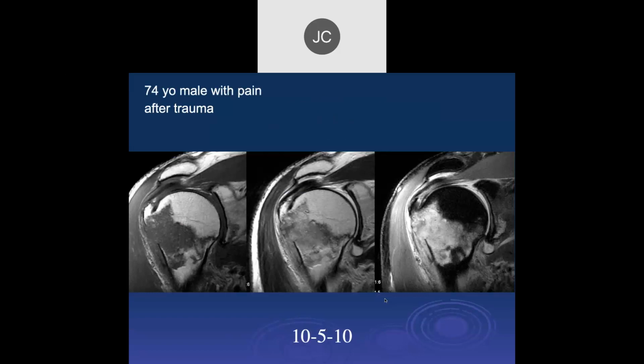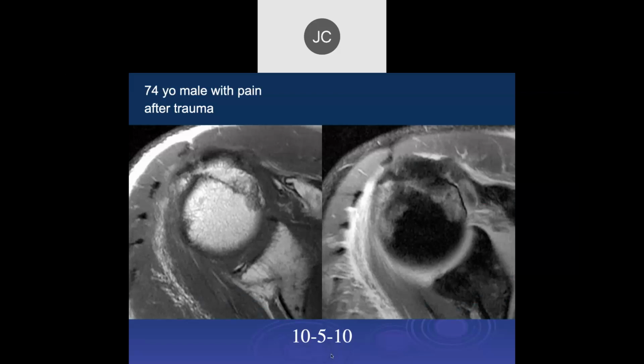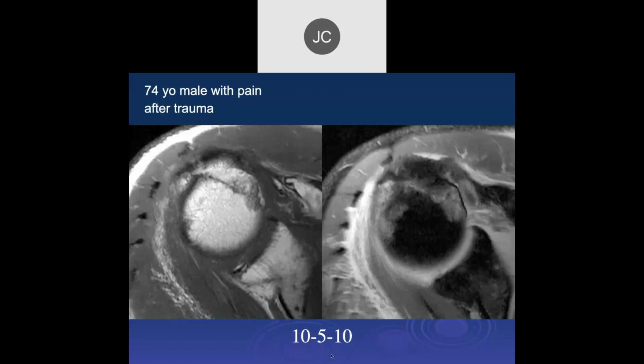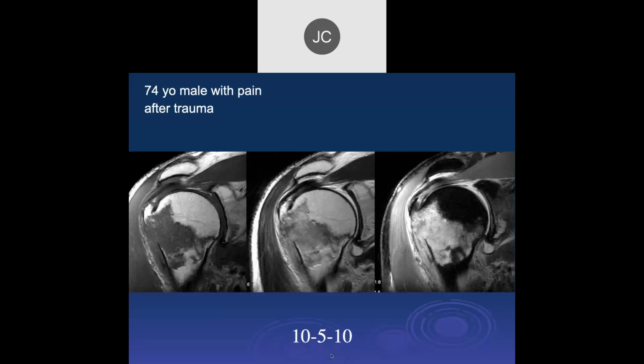Okay. So it looks like we have quite a bit of edema in the humeral head. It might be centered at the lateral aspect. So this patient had trauma. We can also see there's a little kind of osteophyte here, but this looks to me like probably a fracture. Maybe it could be a pathologic fracture. I don't think it was in this particular case, but there could be a mass coming out here. There's a little thickening there, so consider that. Patient had trauma.